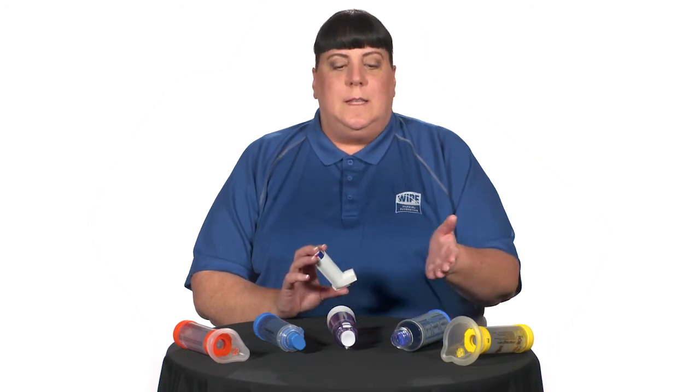There are many types of metered-dose inhalers, or MDIs for short, as well as these tubes called spacers. I'm going to use just one of each of them to show you how to use them, but most of them work the same way. You were given this medicine as a part of a way to help you breathe better and maybe not cough as much. Because you are the most important member of the team that is working together to help you breathe better, I want to show you how to get the medicine from this MDI way down into your lungs so it can help you.